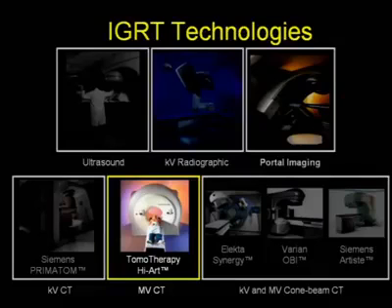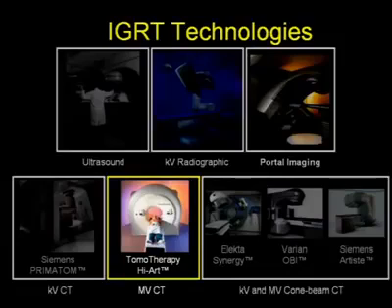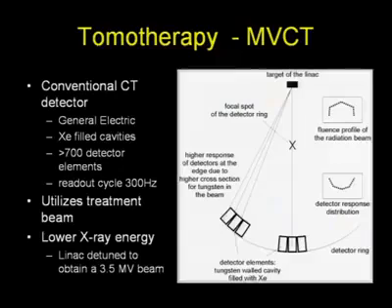The other image guidance technology that is commercially available is the tomotherapy system, which again is a conventional CT with a LINAC mounted on it.